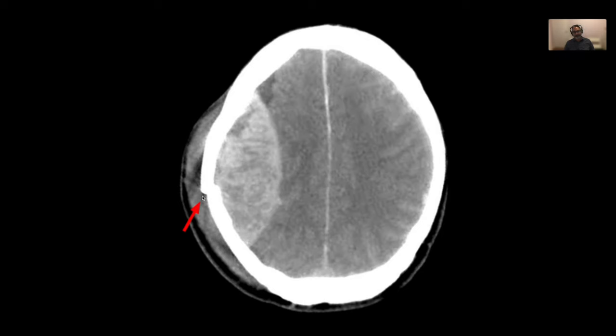Extradural. You can probably even see the fracture here, and you can see the bleeding outside, or the bruise outside, also. Absolutely. So this is extradural.